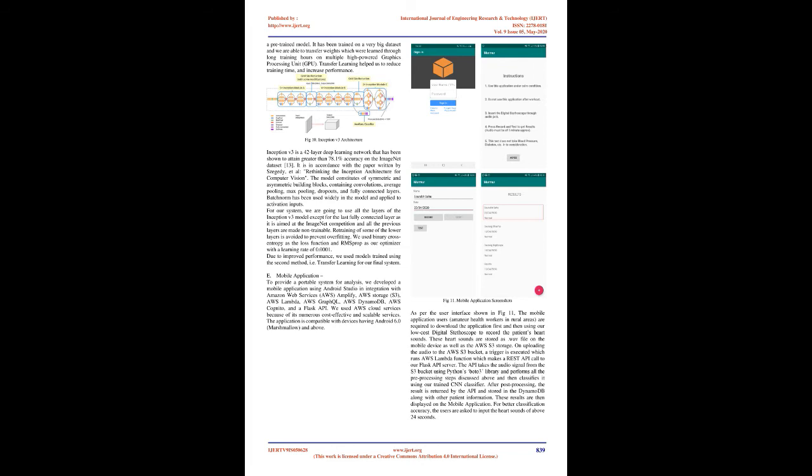Finally, the output layer consists of a single neuron that employs the sigmoid activation function, since we have to classify the input image between two classes, normal and murmur. The CNN model is compiled using Adam as the optimizer and binary cross entropy as the loss function. The model is then trained over different training datasets. Moreover, while testing models trained using this method, we found that the CNN model was overfitting on the training dataset. Hence there was a need for a better classifier model.